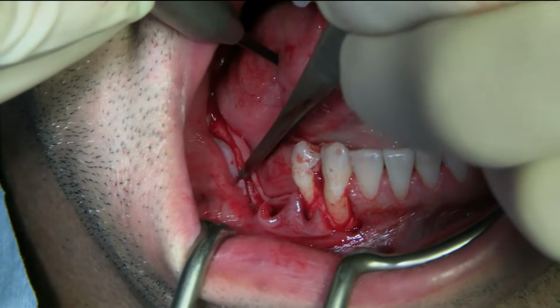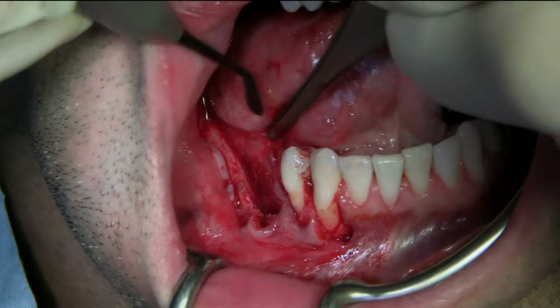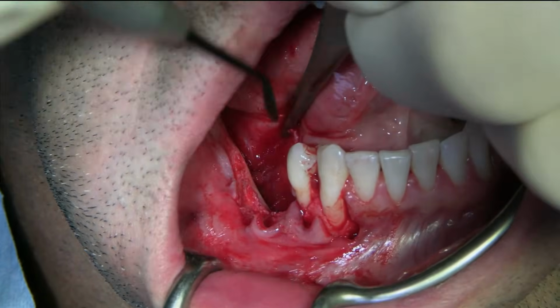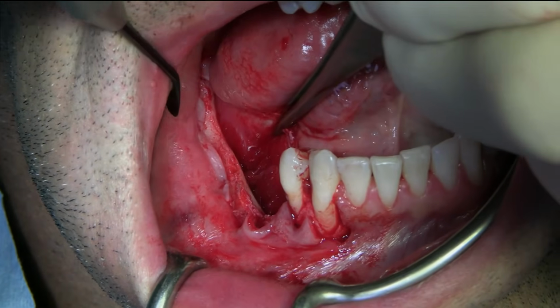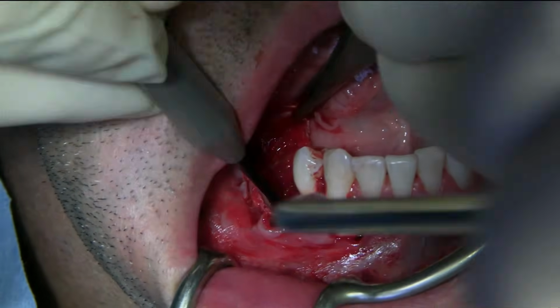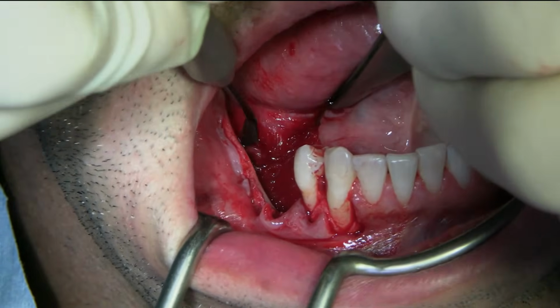See how the lingual flap is already coming up? Can you see that? So here's the lingual already. Releasing it anteriorly, I'm underneath, right on top of the mylohyoid ridge.